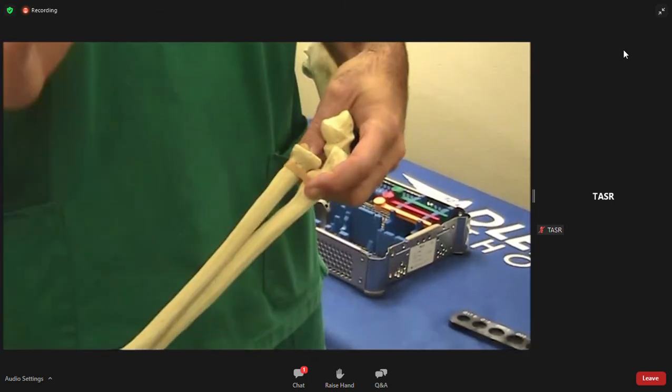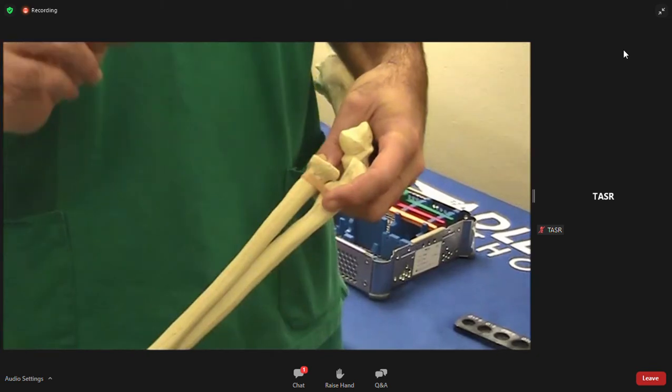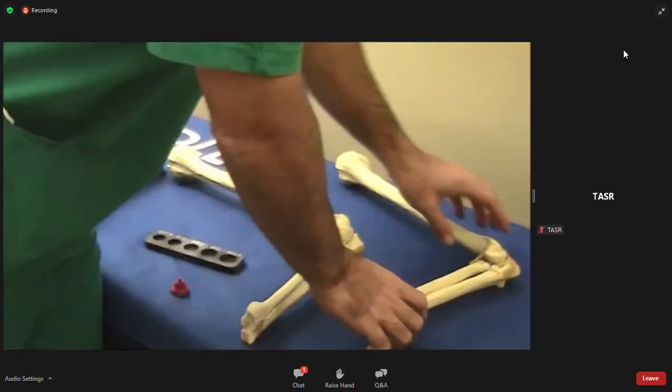So in terms of how to measure the height, I suggest you 2 ways. One is, let's take this model in which there is no radial head.